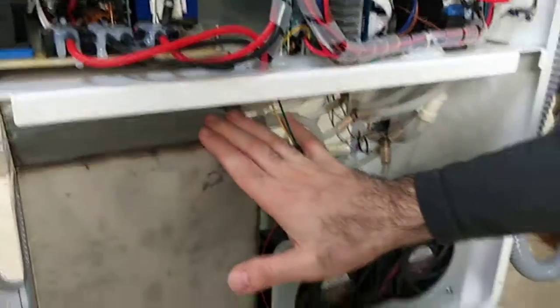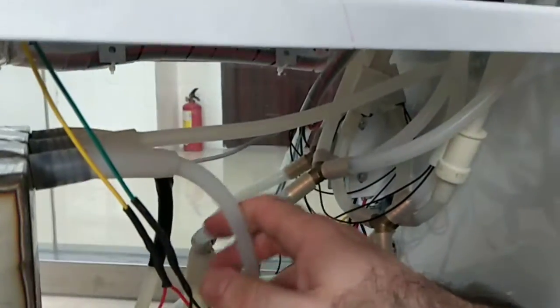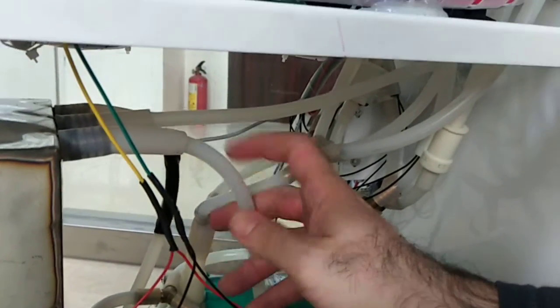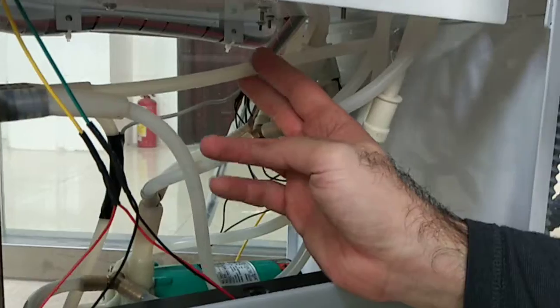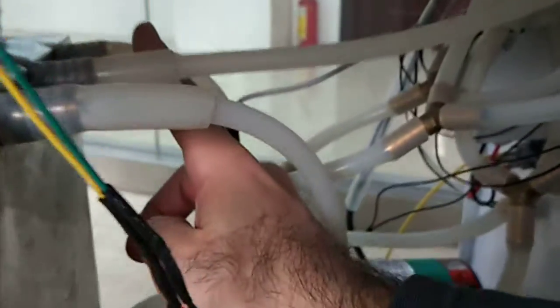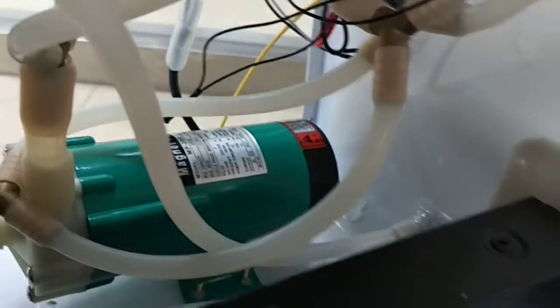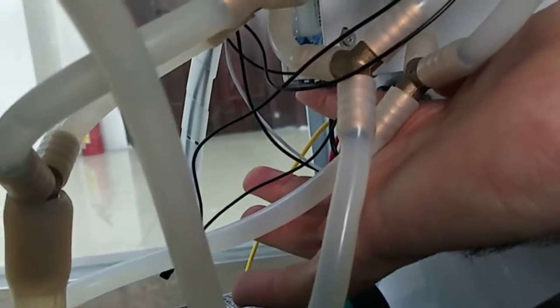That's the water tank, which is quite standard. Now we've got one tube that goes in there. If you watch the video where we're changing the water, this is the overflow, and then we've got this one, which is the inlet, and this one is the outlet for the refrigeration unit. That's the outlet for the refrigeration unit. This one over here is the inlet, and it goes down there, and it goes in and so on. And that is the water pump in there. So let's have a look, the circuit breaker is in there. That's the circuit breaker which we talked about before.